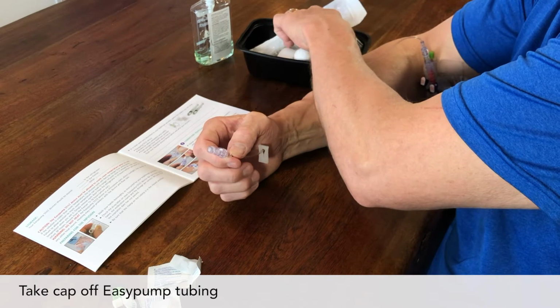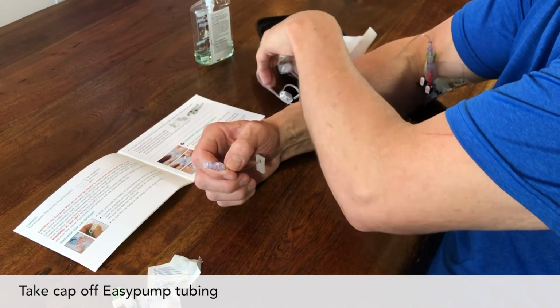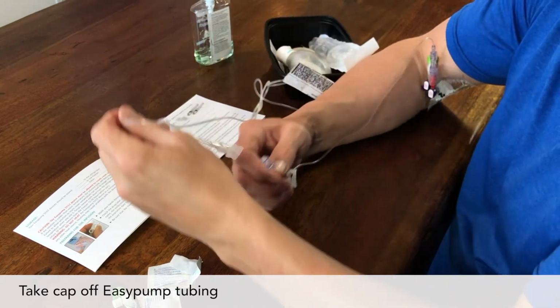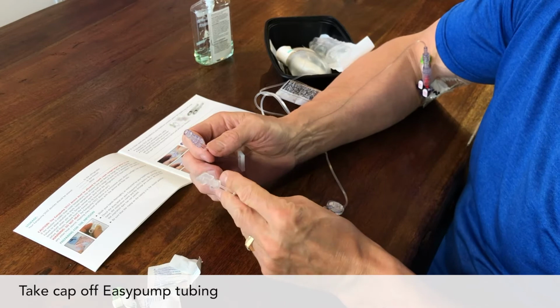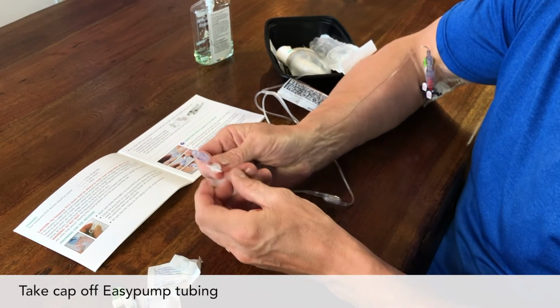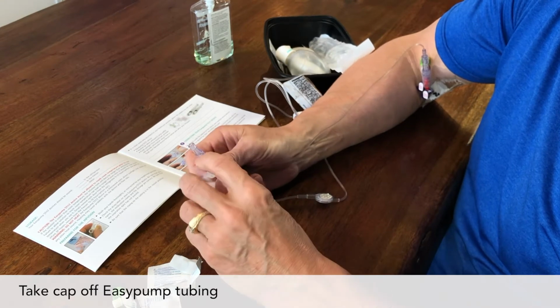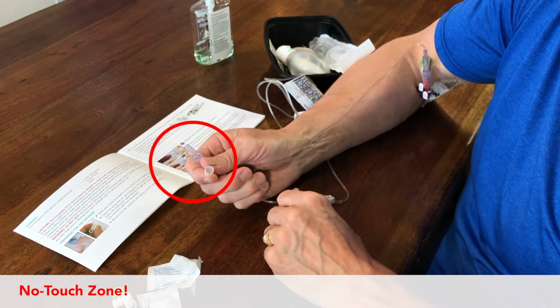Now pick up the end of the pump tubing. Unscrew the cap and let the cap drop. Now this is important. This open end of the tubing is a no-touch zone. This key part cannot touch anything but another key part.